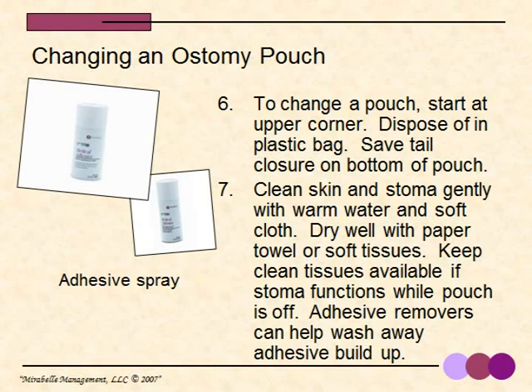Dispose of the old pouch in the plastic bag that you brought, and save the tail closure on the bottom of the pouch. Clean the skin and the stoma gently with warm water and a soft cloth. You want to dry the area well with the soft paper towel or soft tissues. Keep clean tissues available if the stoma functions while the pouch is off. Adhesive removers can also be used to help wash away any excessive adhesive buildup.